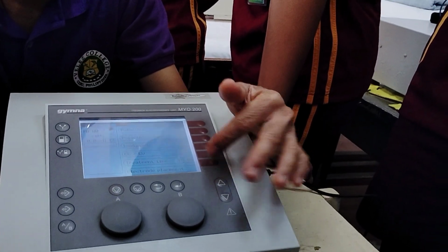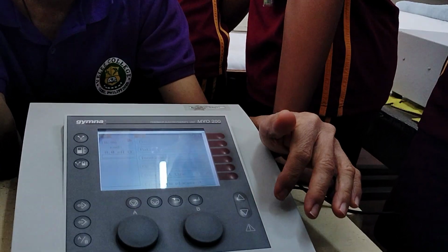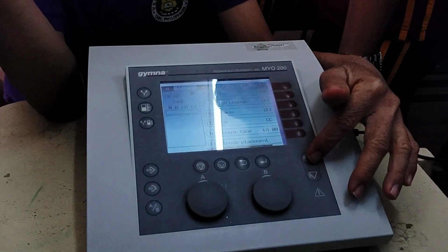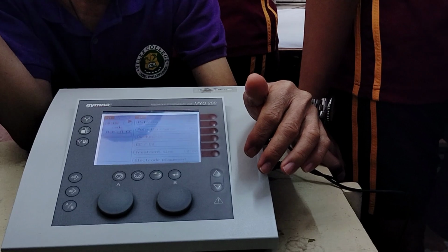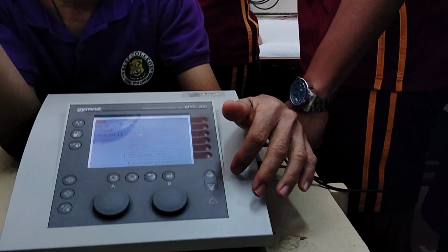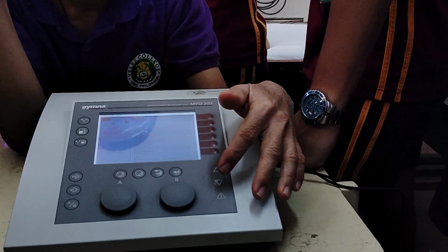So, what's one advantage? But the disadvantage, especially for the therapist, is the tendency that the therapist will no longer use his own thinking or analysis of the parameters to apply. It needs a preset. So, if you get used to presets and then encounter a modality without a preset, there are times you will be confused about your parameters. So, there's a problem there.